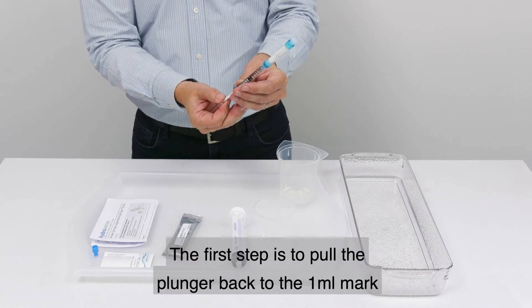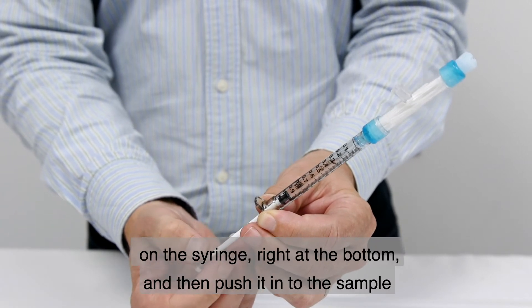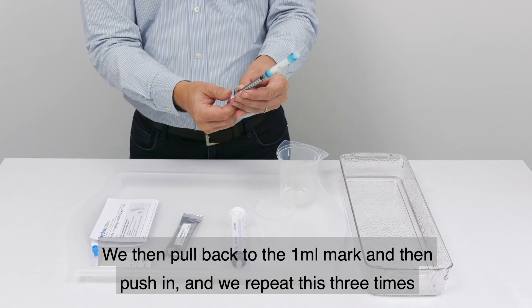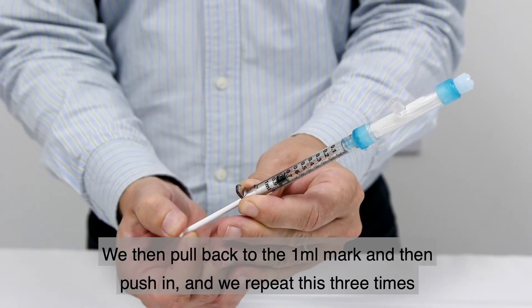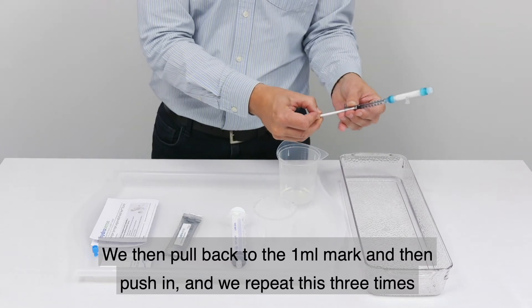The first step is to pull the plunger back to the one millilitre mark on the syringe at the bottom, and then push it into the sample. We then pull back to the one millilitre mark and push in, repeating this three times.